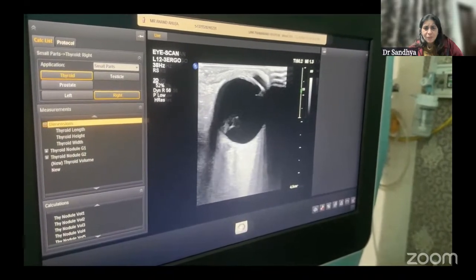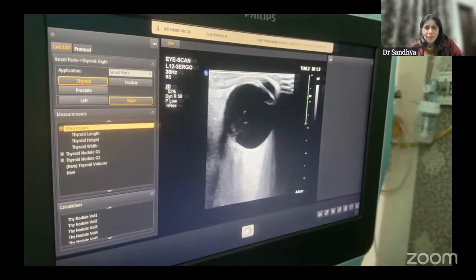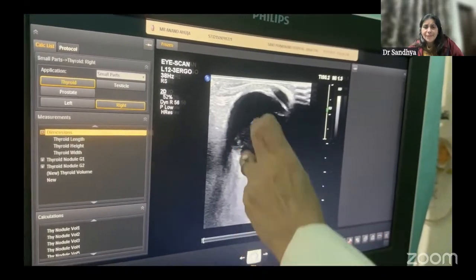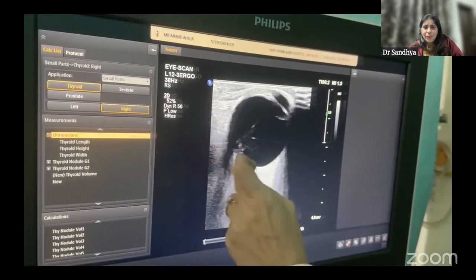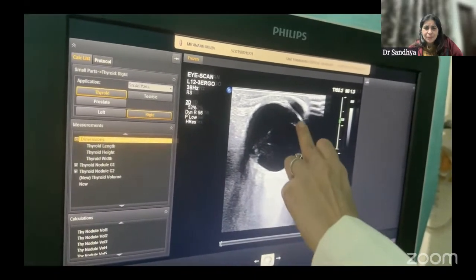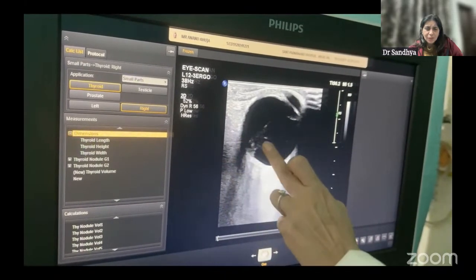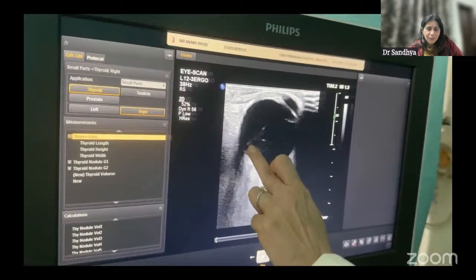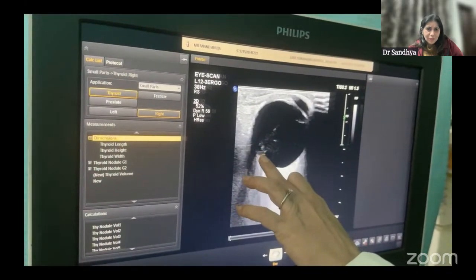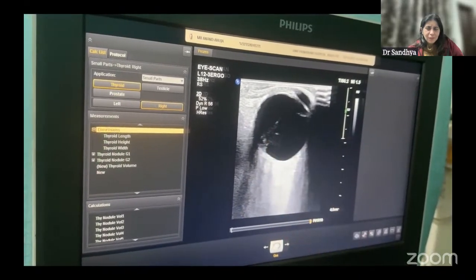So here we look for the details of the membrane. See, these membranes are getting attached at some point to some temporal retina. So this means this is a case of vitreous hemorrhage. There's the PVD, and the posterior vitreous membranes are getting attached to this point somewhere in the temporal periphery of the retina. And there could be a small fibrovascular front which is kind of pulling on the retina.